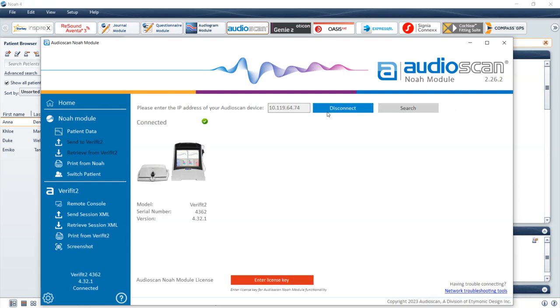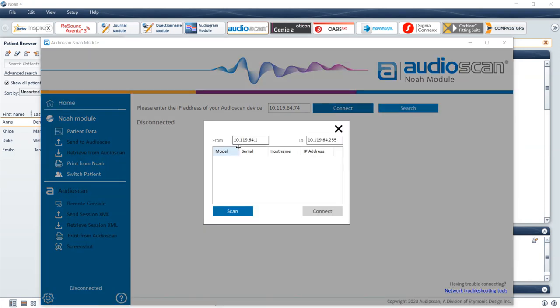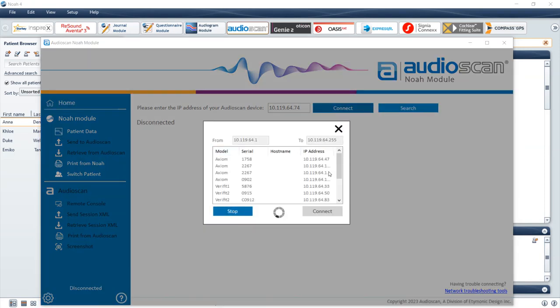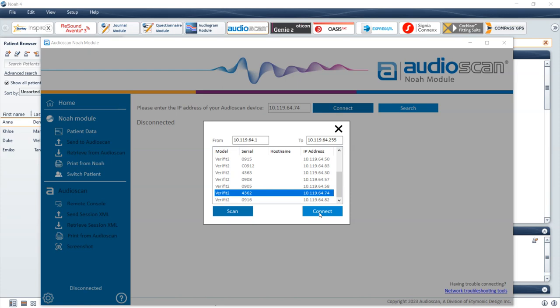Alternatively, you can search an IP address range. Select Scan to search for your AudioScan device. Once a system is found, select the text showing the model name, serial number, and IP address of the AudioScan you would like to connect to. Select Connect for connection to the selected AudioScan equipment.